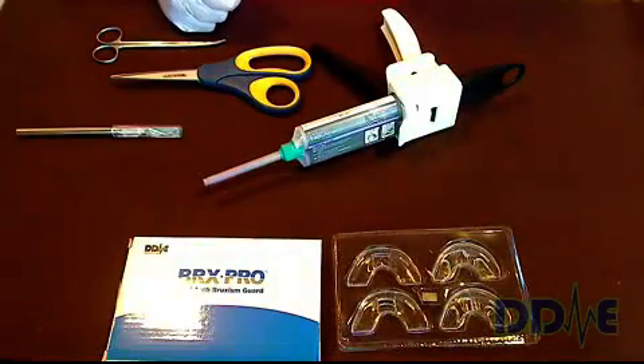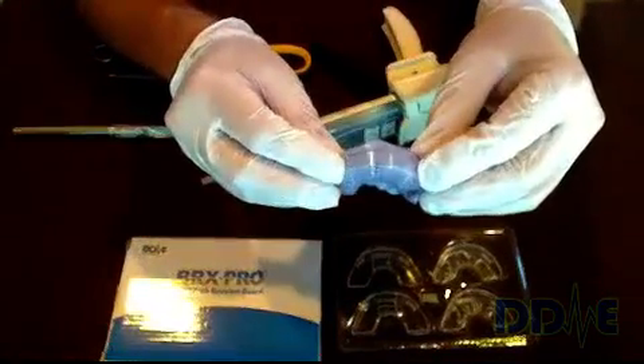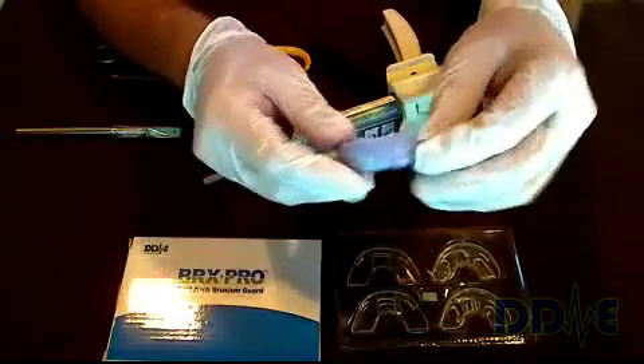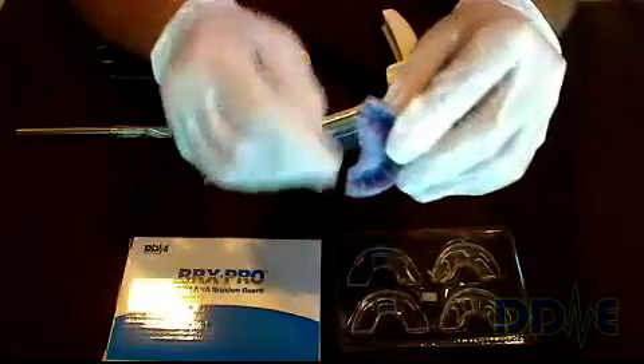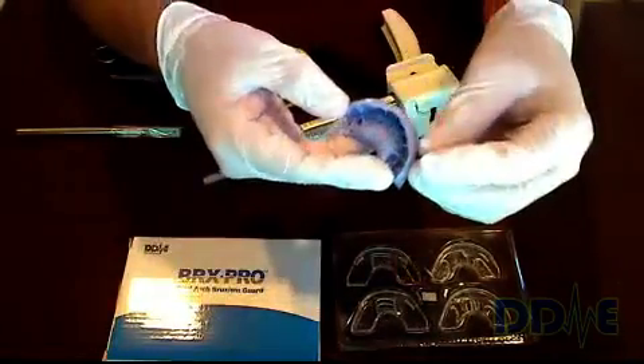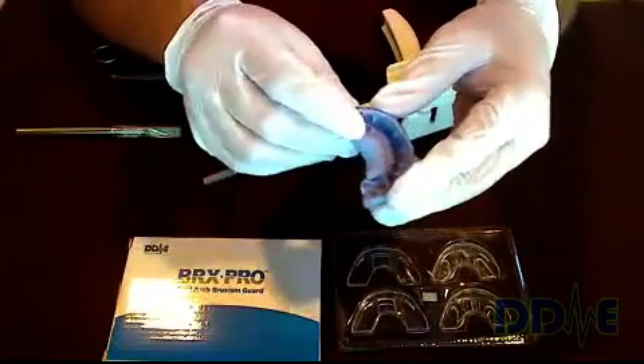Once you've done that for the upper and the lower, you end up with an impression not unlike this. The next step is to trim up the PVS material off the impression tray, then remove the insert and do a little more trimming.